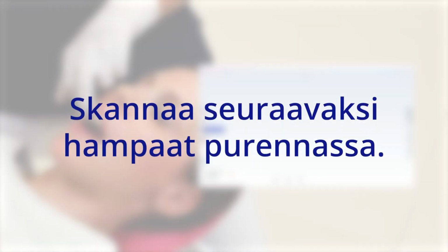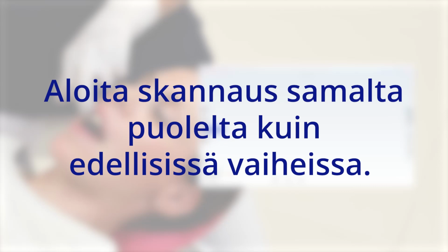Continue to scanning the teeth in occlusion. Start the scan from the same side as the previous scans. Start with the buccal surface of the upper molars.